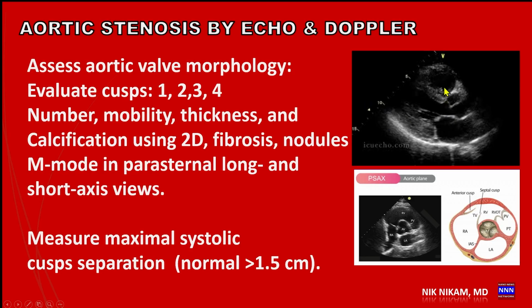We can also look into an M mode for measurement of timings. We look at the right ventricular size to see if the patient has associated heart failure, which may reflect in terms of pulmonary hypertension. And here's a cross section of the aortic root where we're going to look particularly for bicuspid and unicuspid valves. Usually bicuspid is common in the adult population, but in pediatric population it's not uncommon to see a unicuspid aortic valve with a tiny pinhole type of narrowing.